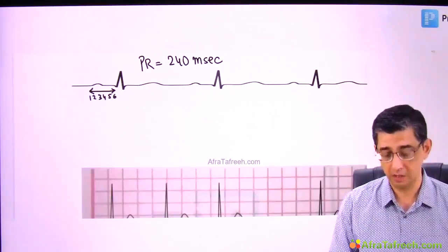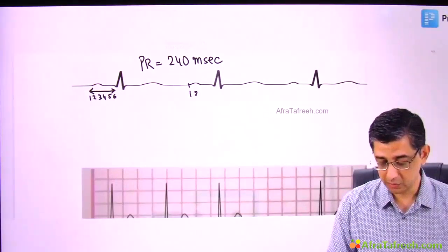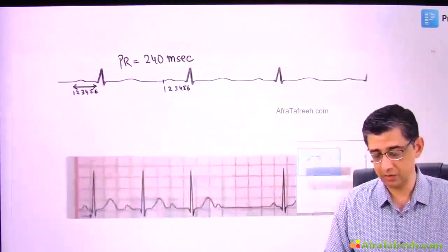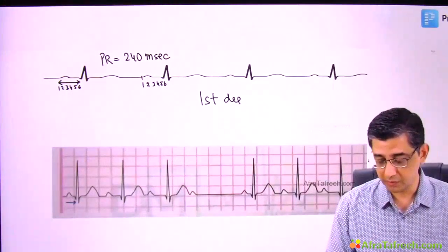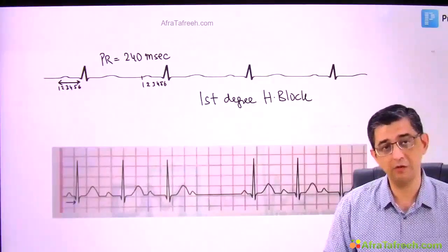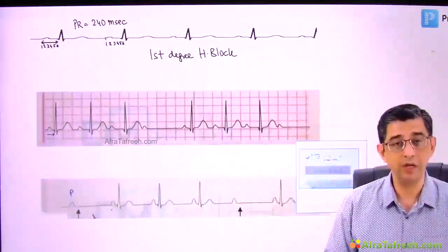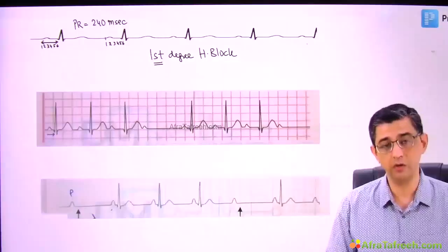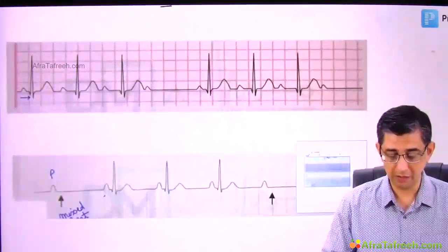That's pretty substantial. If I do this activity once again, you will notice that the number of small squares is almost going to be the same. I've still highlighted approximately 6 small squares present. So this ECG is highlighting presence of first degree heart block. The main issue with this person would be that either he could be a marathon runner or he could be having any of the pathological reasons we discussed, ranging from rheumatic fever onwards, and the defect in the heart of this person will be between the SA node and the AV node. Please remember the fact that per se first degree heart block would be benign in nature and would not contribute to any chances of death.